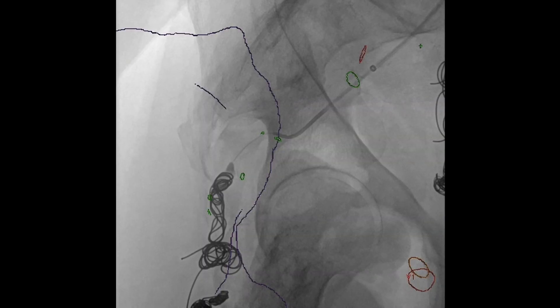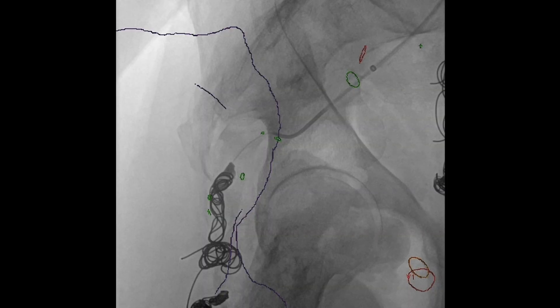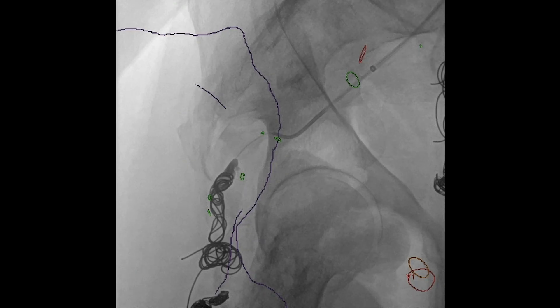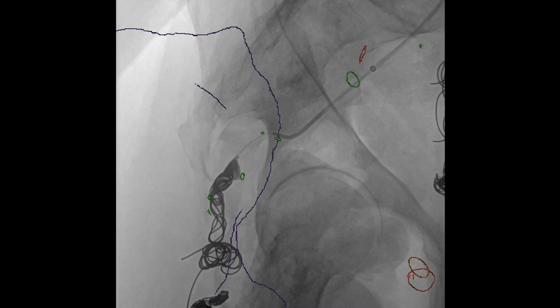It's difficult to see, but there's a micro catheter in there, and so we backed this up by placing onyx. The advantage of onyx is it gives you a solid plug and will also follow down into the second and third degree branches to help ensure adequate devascularization.